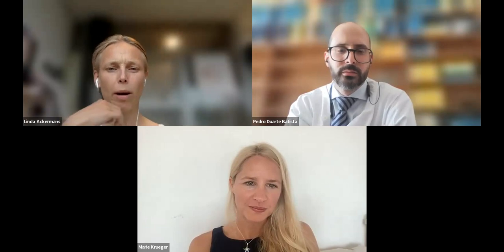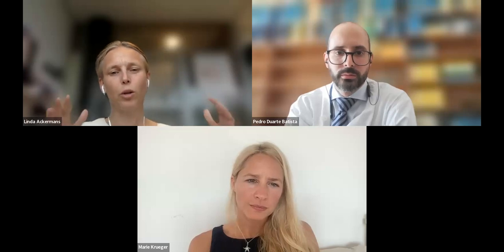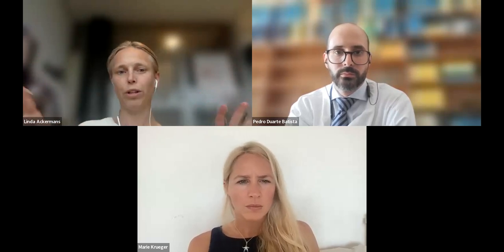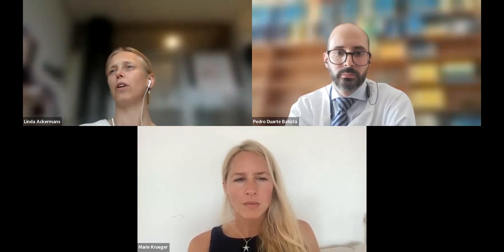What's your opinion, Linda? I think remote programming is a big advantage, but I really like to have one complete setup of all the information for the patient in one single device, like the contacts, the electrodes, the steering electrodes, the position, the MRI scan on a really tiny tablet or display, which I can show to the patient as well. And not all the different planning stations on all different devices. I think that should be a big advantage.